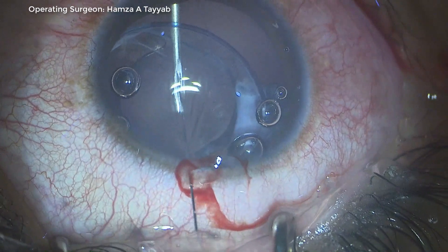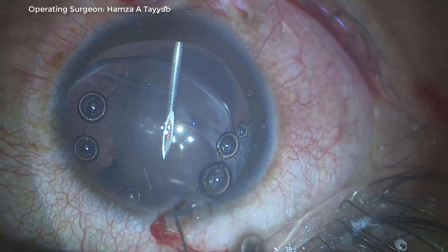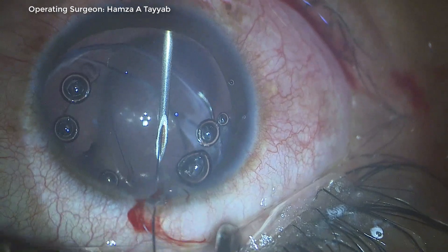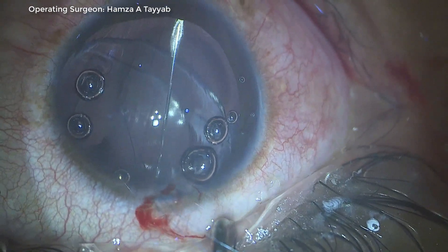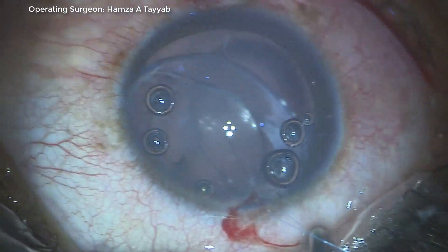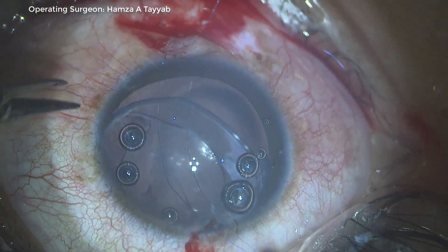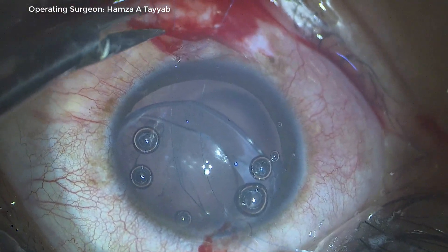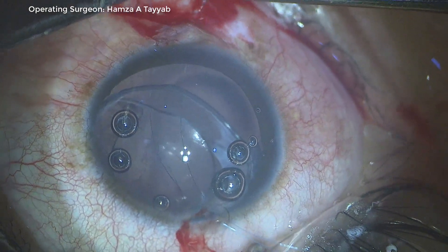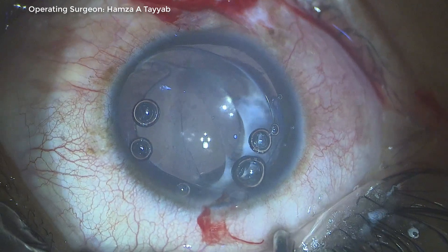This is a very simple mistake, however as you saw it can complicate surgery — a 10-minute surgery was prolonged to 30 minutes. Please avoid this complication if you try this wonderful technique. I pull both sutures, praying that this time I have not taken a bite of the corneal stroma. As I pull on both loops, the loop passes through and I breathe a sigh of relief.